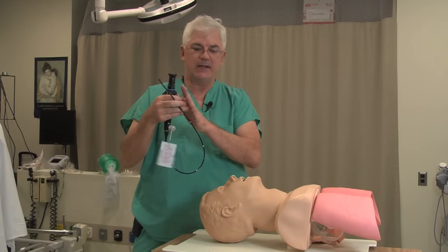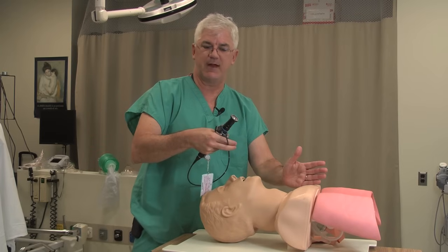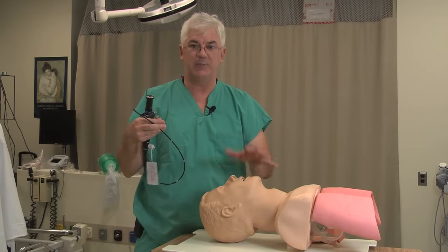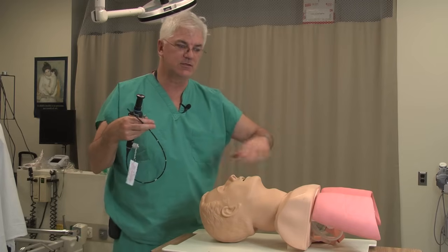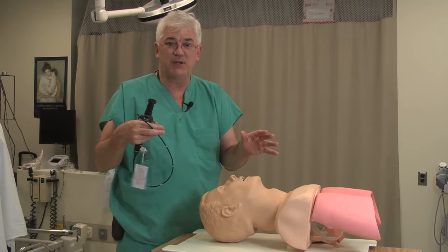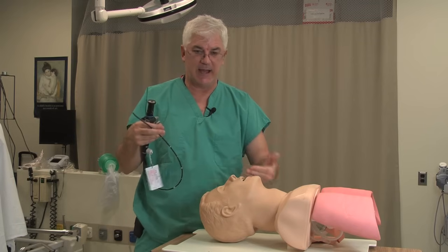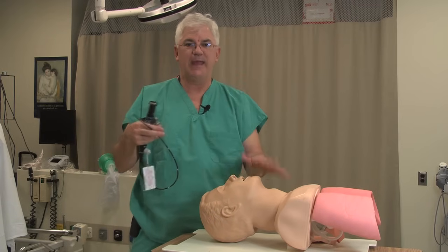A fiber optic intubation can be done asleep — you can induce the patient and then put the fiber optic in — or you can do it awake. I am a big proponent of intubating awake. If you feel the patient's airway is difficult and you might have trouble, keeping the patient awake means you have not burned any bridges. As soon as you induce or give muscle relaxant, you start burning bridges and might not be able to mask them. Awake intubation involves explaining it to the patient, topicalizing well, sedating appropriately, and then doing the fiber optic.